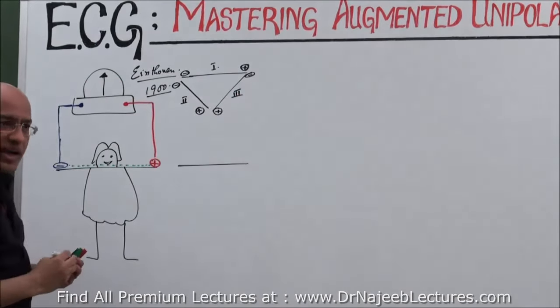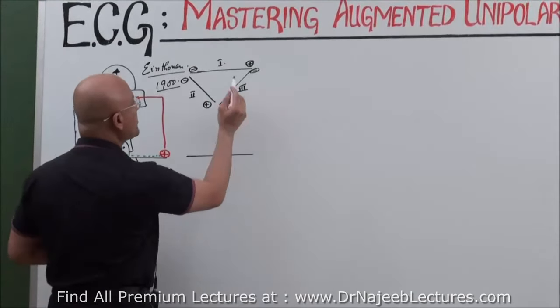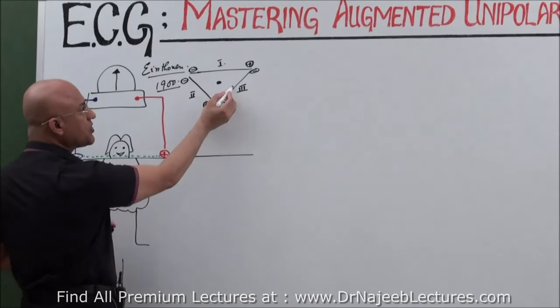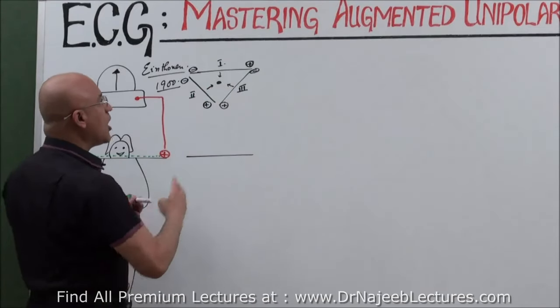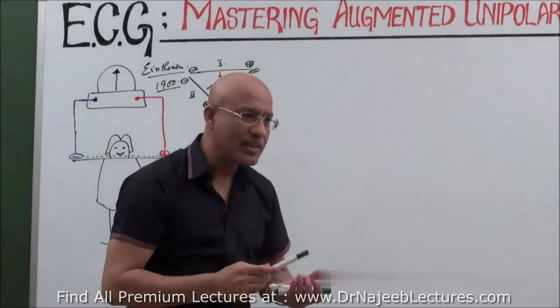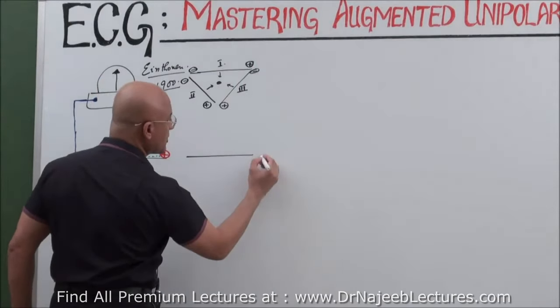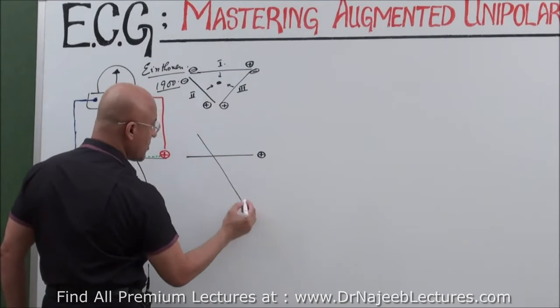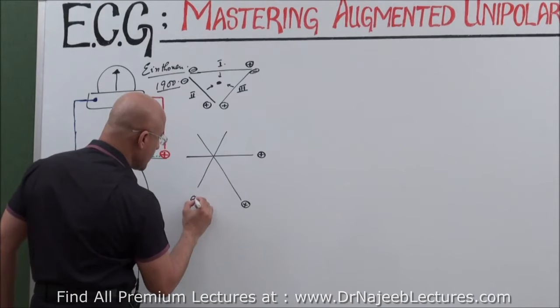Is it clear? And in the last lecture I said, if we slide these leads to the center of the triangle, this is the center of the triangle, to see how they are angulated relative to each other, how they are oriented to each other. So we discussed, if this is lead number one with the positive electrode here, you remember that? Yes. Then this should be lead number two, and here should be lead number three.